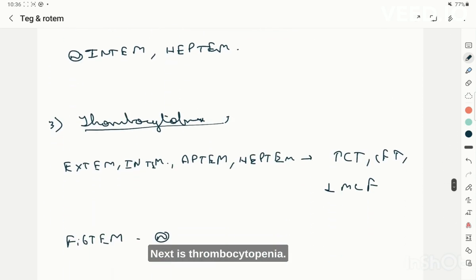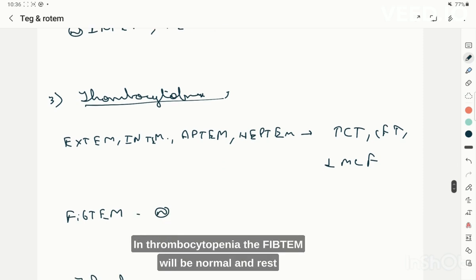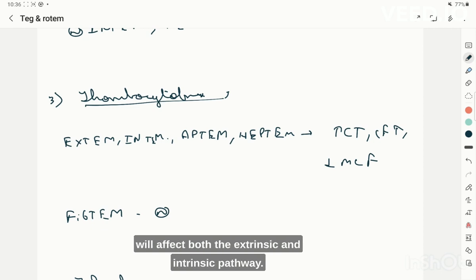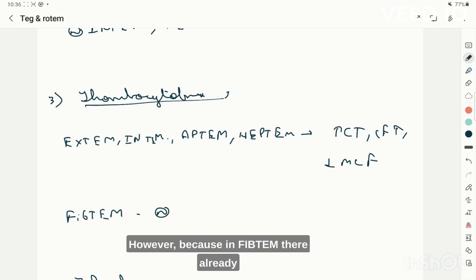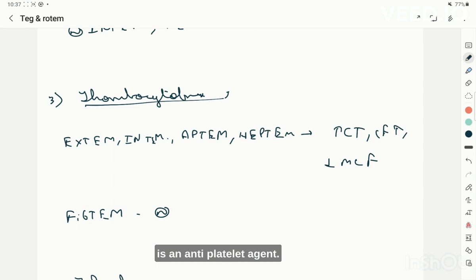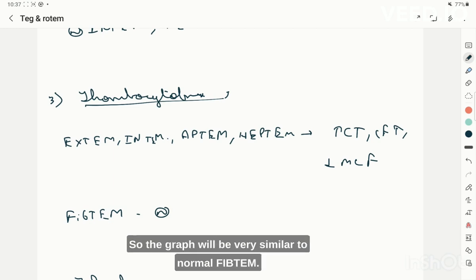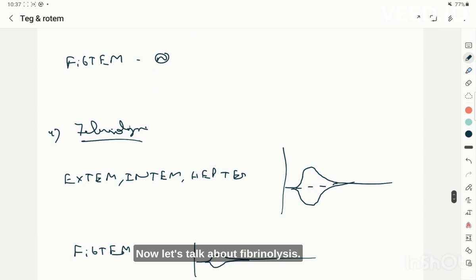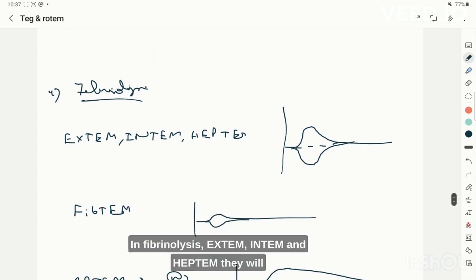In thrombocytopenia on ROTEM, FIBTEM will appear normal because it already contains an anti-platelet agent. All other graphs — EXTEM, INTEM, APTEM, and HEPTEM — will be deranged, since platelets affect both the extrinsic and intrinsic pathways, but their derangement will resemble the FIBTEM pattern.